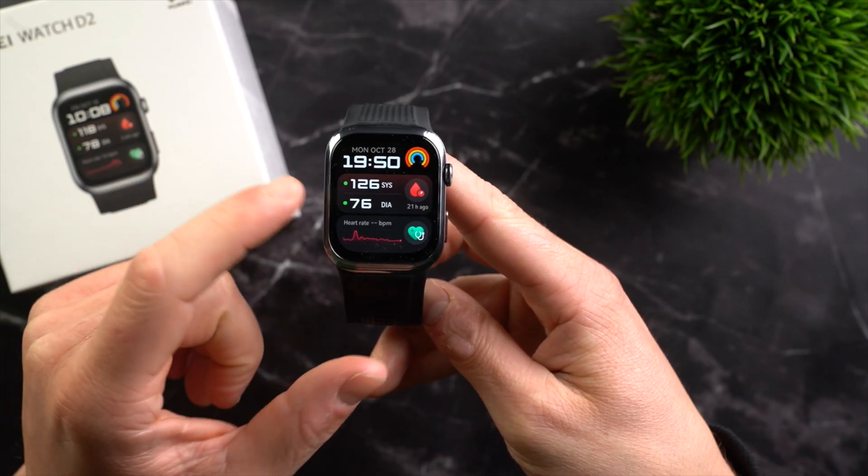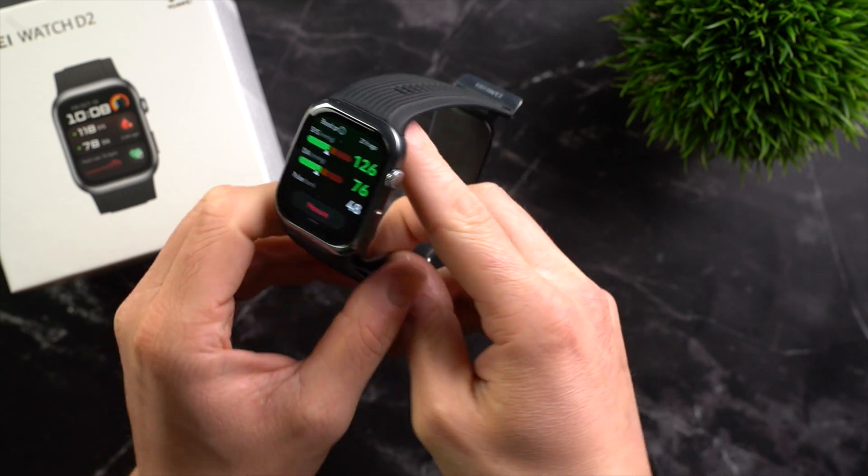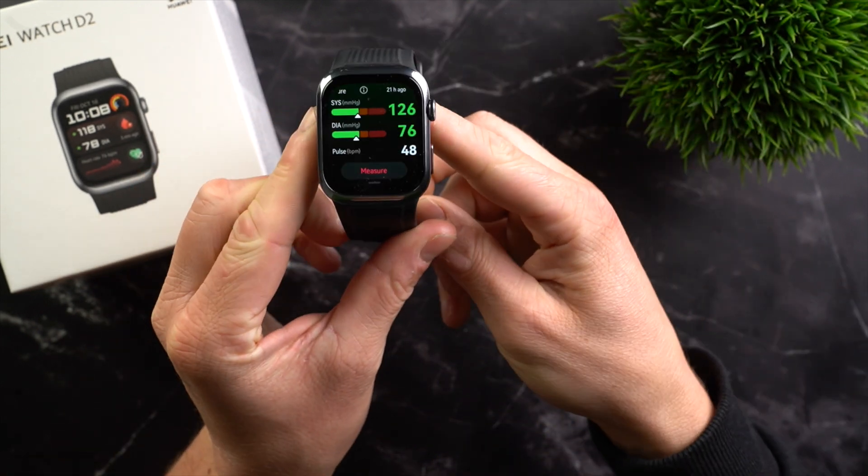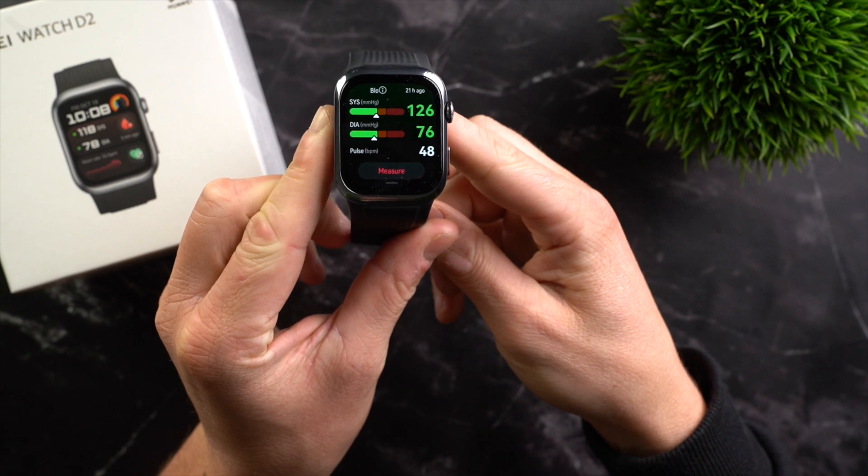This watch can measure blood pressure directly at the wrist. This is the new Huawei Watch D2 — a smartwatch with a built-in air cushion in the strap that inflates to measure blood pressure. At least that's the theory. In today's video you will find out how accurate this type of blood pressure measurement actually is, what else the Huawei Watch D2 has to offer, and for whom it is the right choice.